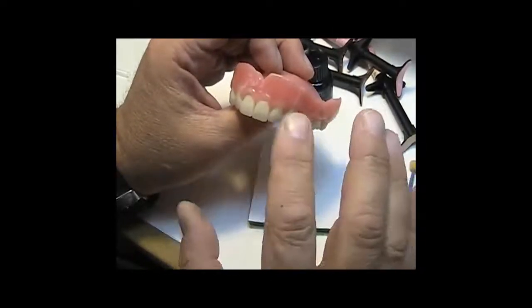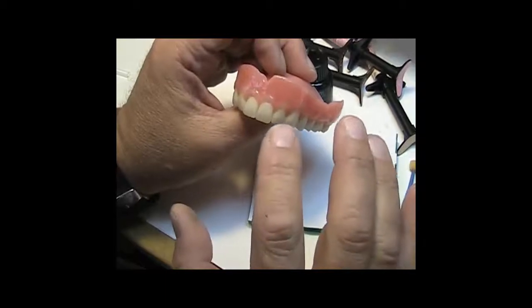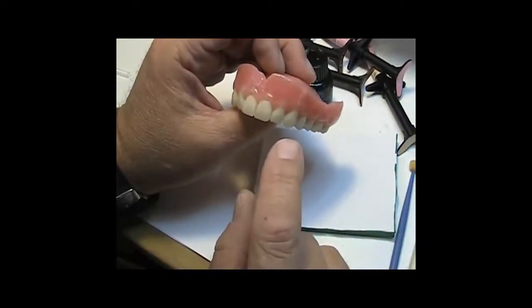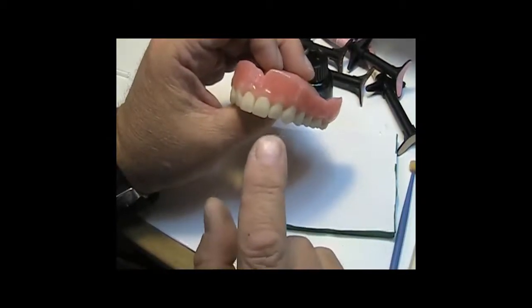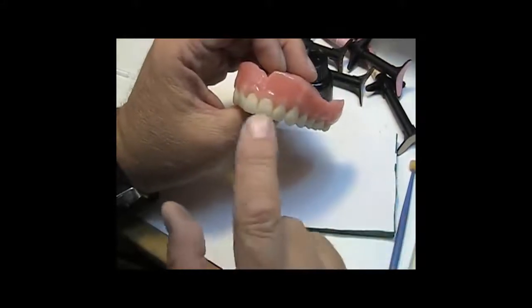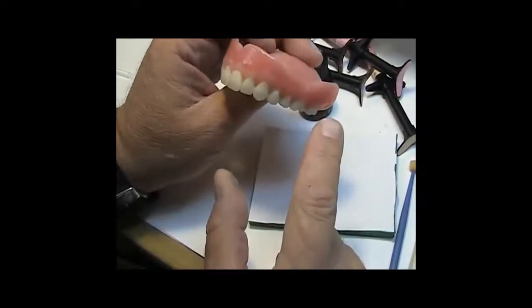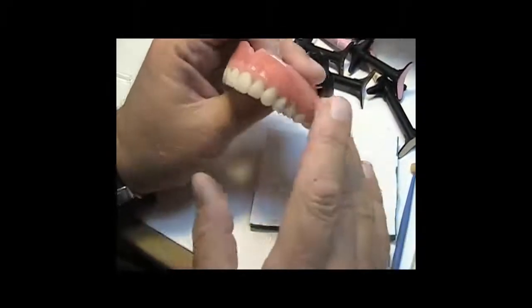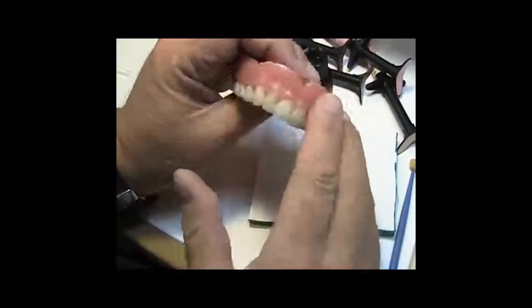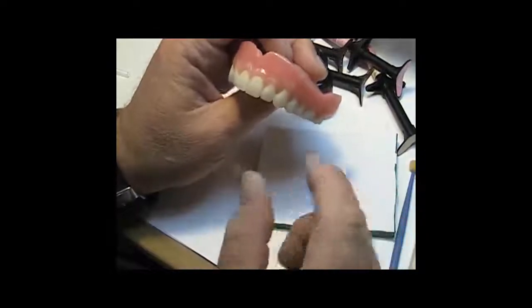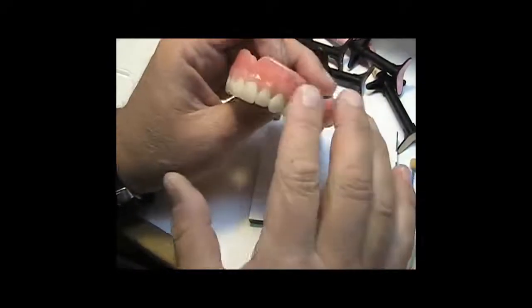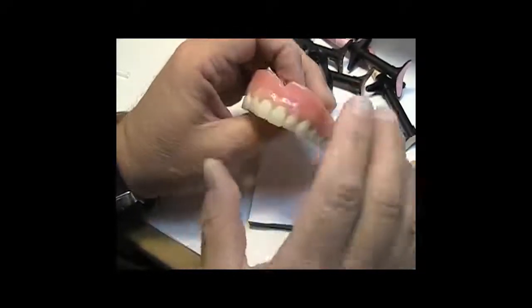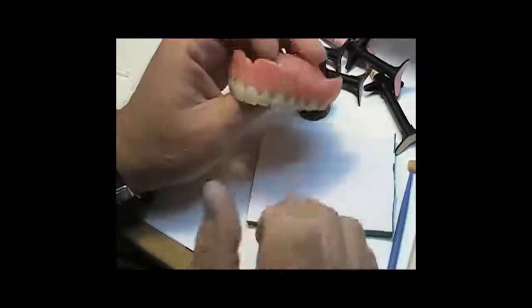If you stick this in for a minute and a minute and a minute, I mean you're over-curing it. Try to keep your total curing time under a minute totally in order to prevent it from burning, and burning will show up not initially, but burning will show up later because it will yellow. It will only take a few days, and it will yellow because it will be burned. This is already, there's no tackiness or nothing. I'm just going to put it under for another 20 to 30 seconds.